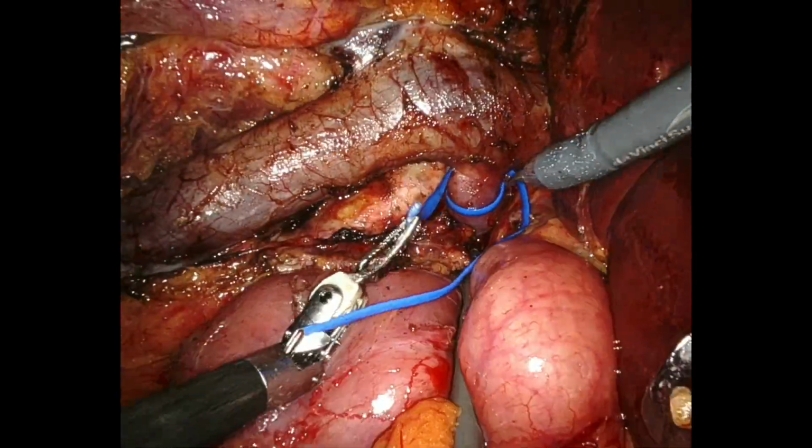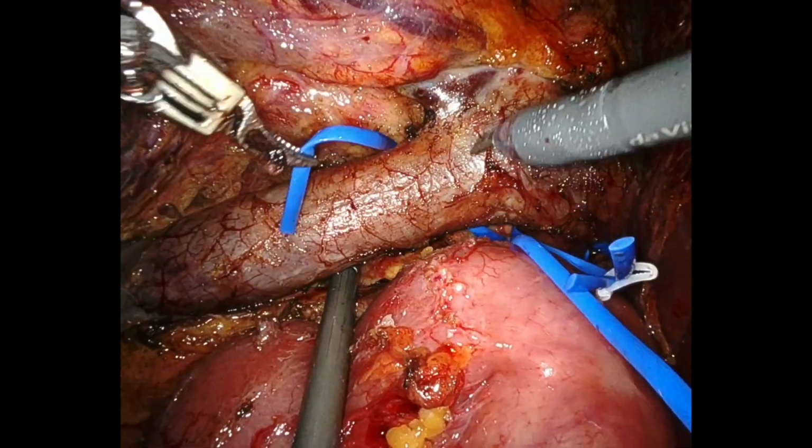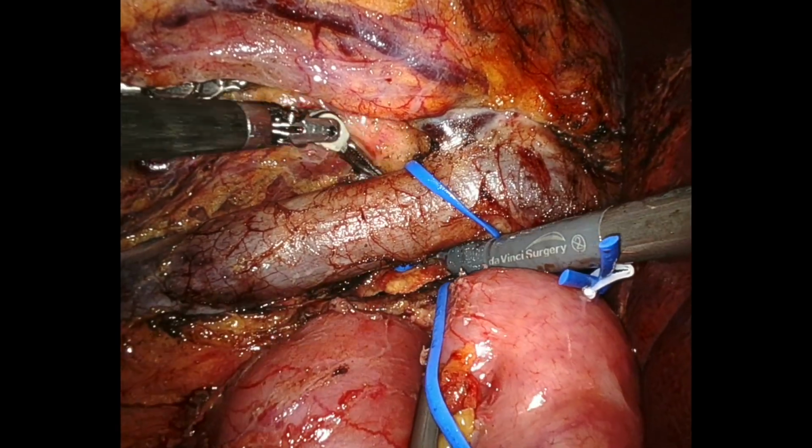A vessel loop is placed over the left renal vein, the subrenal vena cava, and the subhepatic vena cava.